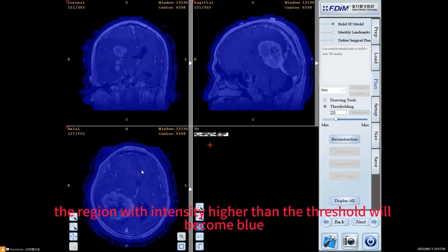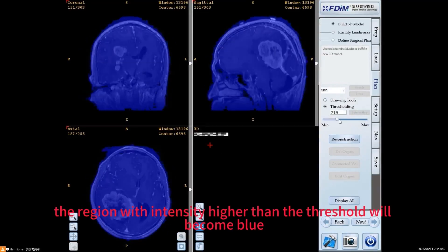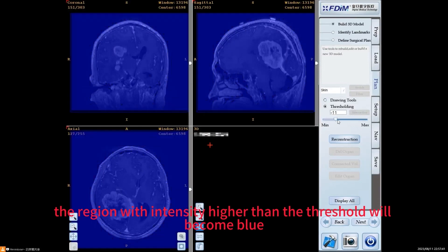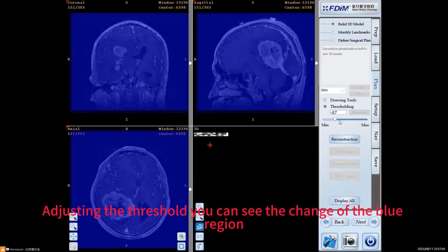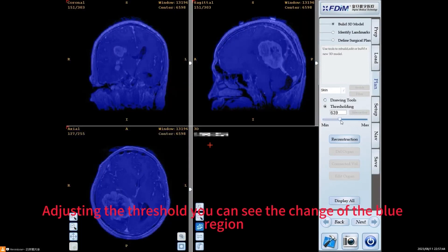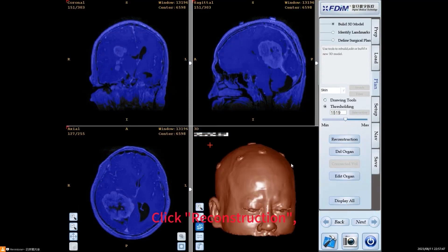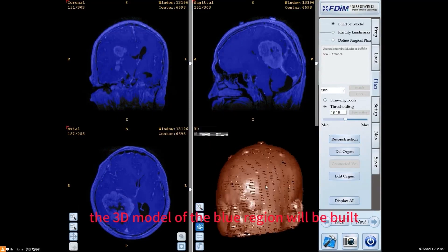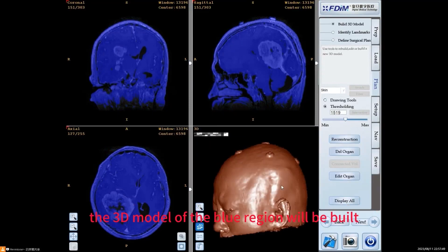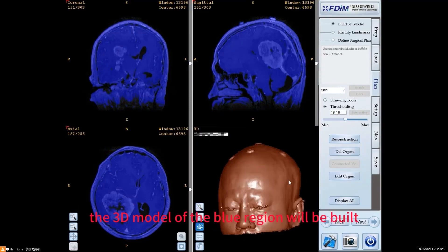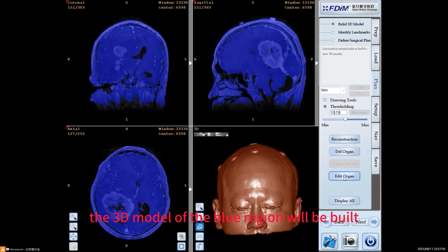The region with intensity higher than the threshold will become blue. Adjusting the threshold, you can see the change of the blue region. Click Reconstruction. The 3D model of the blue region will be built.